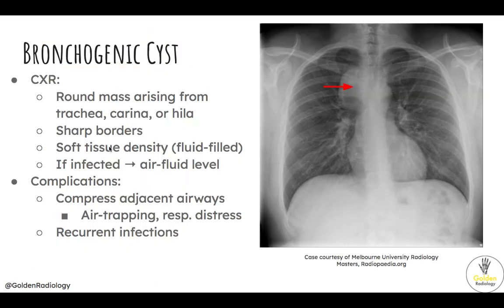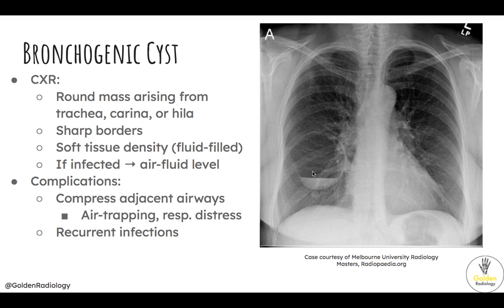Bronchogenic cysts will typically present like this — a round, soft tissue mass with sharp borders arising from the trachea, carina, or hila on either side. These cysts are typically asymptomatic; however, they can get infected, in which case they may show an air-fluid level, as shown here. They can also have a mass effect compressing adjacent airways, which leads to air trapping and respiratory distress.